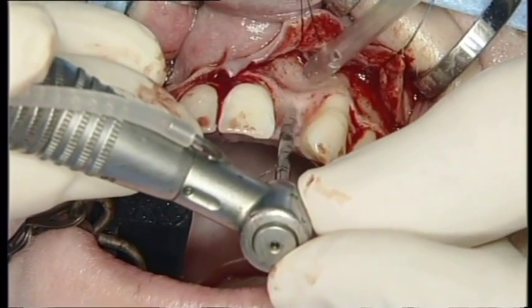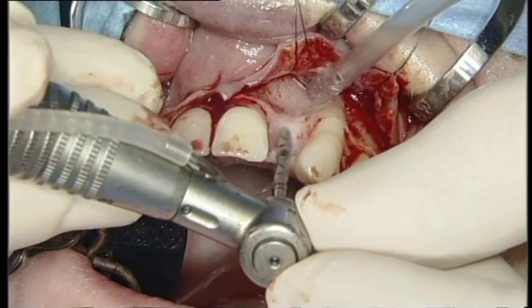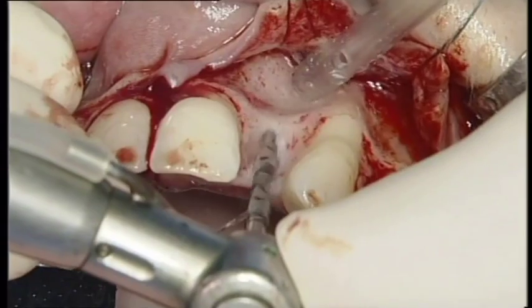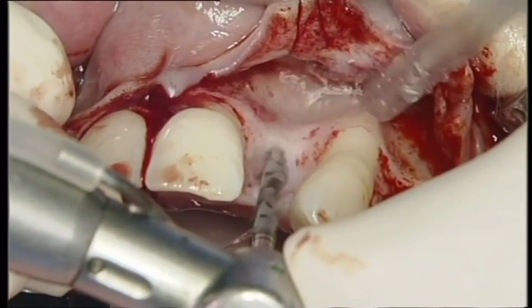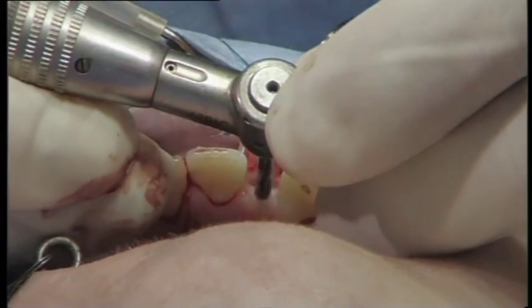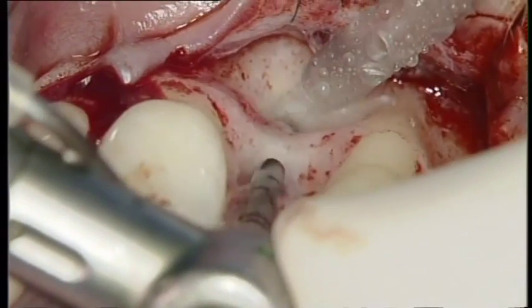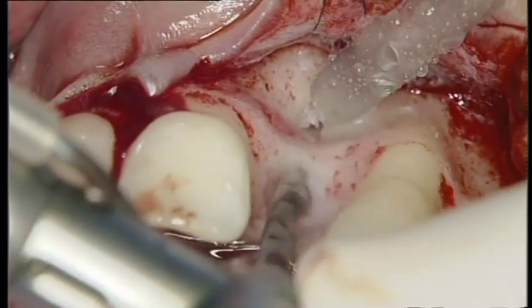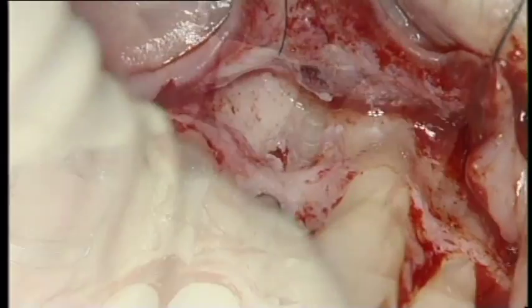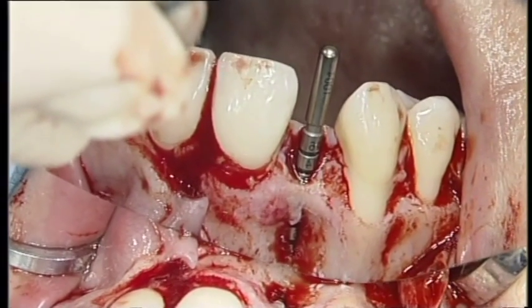The first 2.2 millimeter spiral drill is now used in the correct direction and angulation to carry out the initial preparation of the implant bed. As expected, the drill perforates the facial bone because of the bony undercut. A 2.2 millimeter depth gauge is inserted to check the sink depth and axis of the first preparation.